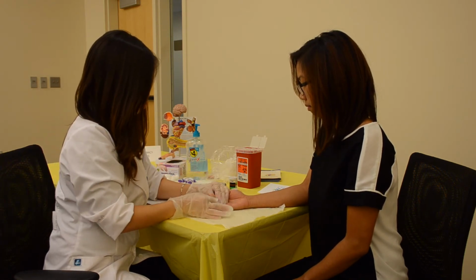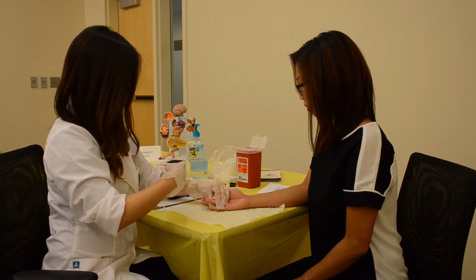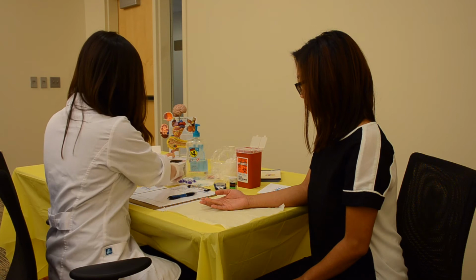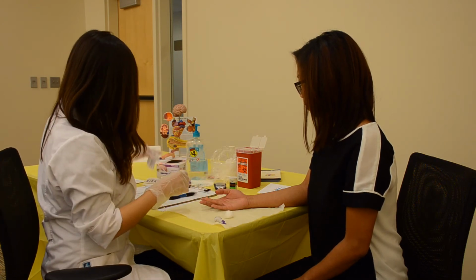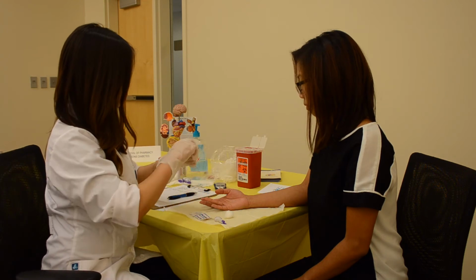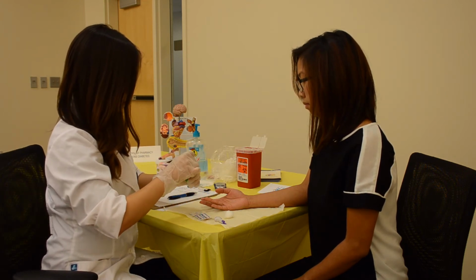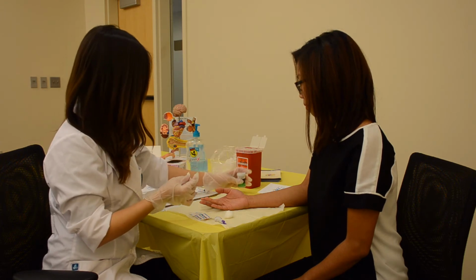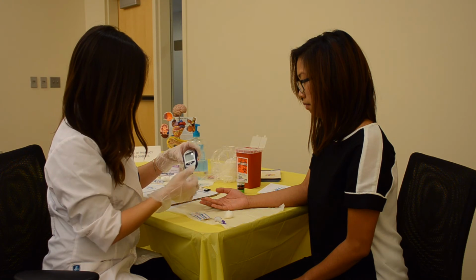Let the alcohol dry. If you do not let it dry fully, the alcohol can affect the blood sugar reading, making it artificially low. Remove a test strip from the vial. Insert the strip into the blood glucose meter and it will automatically turn on. A blood drop will appear on the screen and that shows the meter is ready to read.